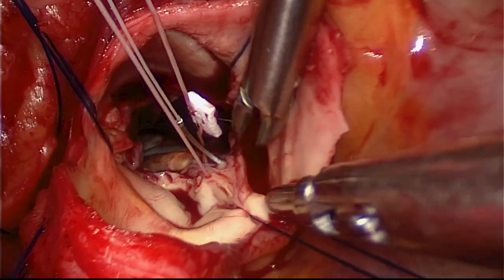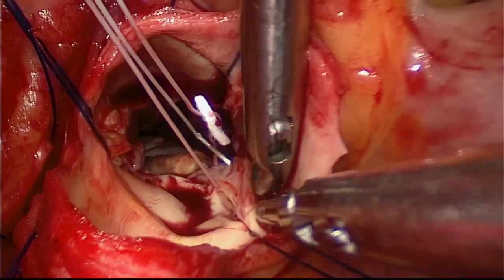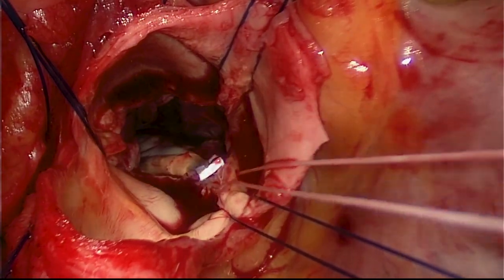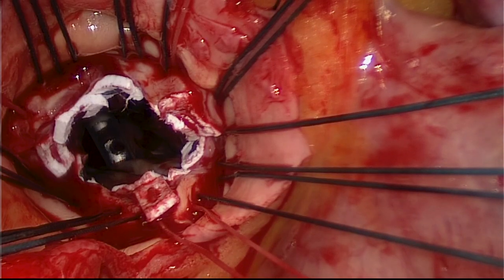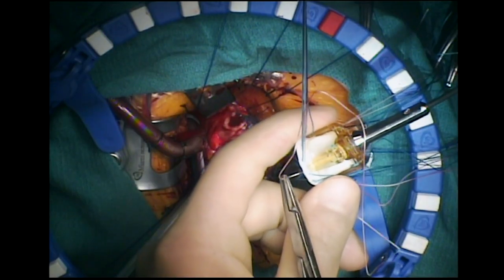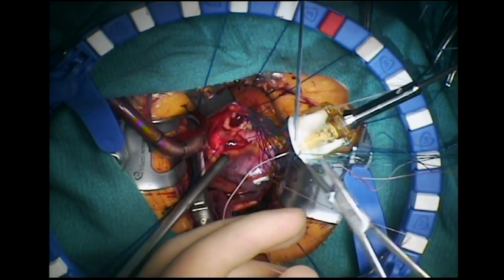One may implant a sutured or a sutureless valve. Here you see the placement of pledgeted sutures for a supra-annular implantation of an aortic valve. The view is excellent, and single-shafted instruments with their lower profile make it easier to see clearly.